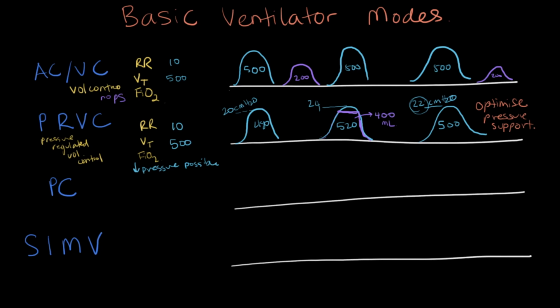Okay, and we'll move now on to pressure control ventilation. And in the first two modes, we talked about setting the volume and monitoring the pressures. But in pressure control, it's going to be the opposite, where we set the pressures and we monitor the volume, or the volumes can change. So we're going to be setting the rest rate again.